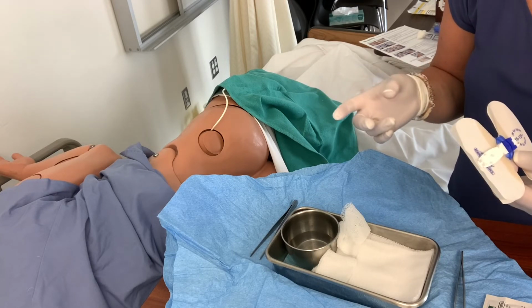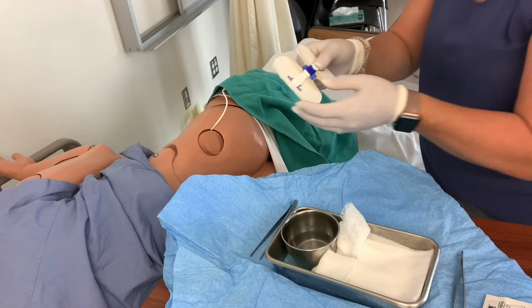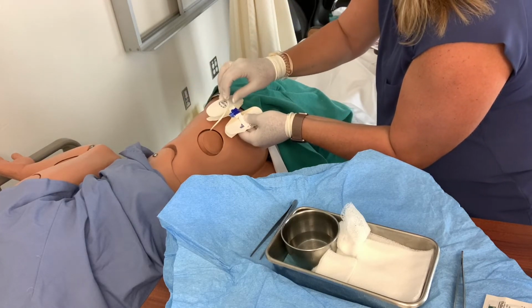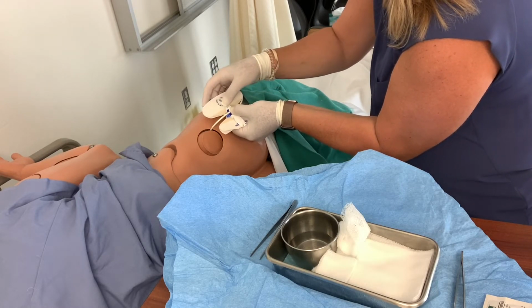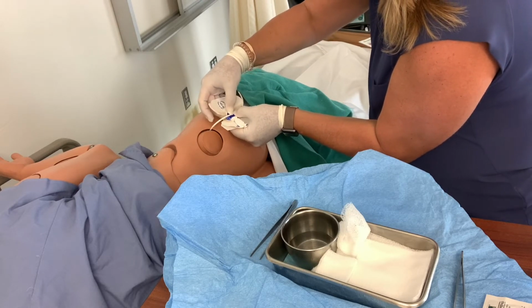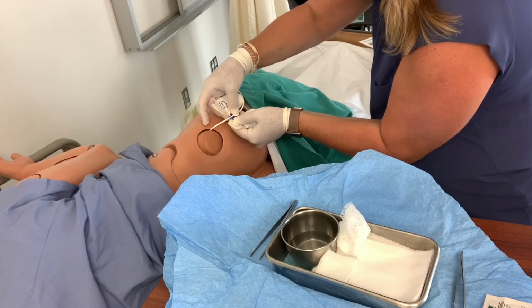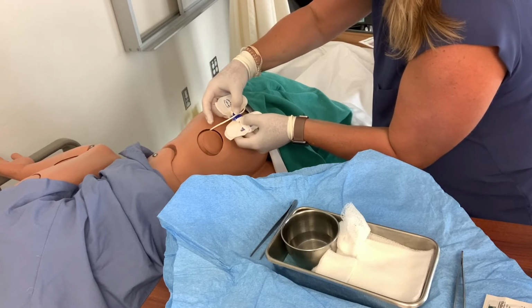It's the same kind of idea as the PICC. You don't want to forget about the insertion site of the PICC while you're trying to put the StatLock device on. So I'm going to take the StatLock device, and remember I'm sterile, so I've prepped this part. I want it to lay down flat, so I'm going to take the tube, and since I'm all sterile I can touch all of this, and I am trying to push it down into the little channel there. Once I get it in it'll stay, but it's kind of hard.